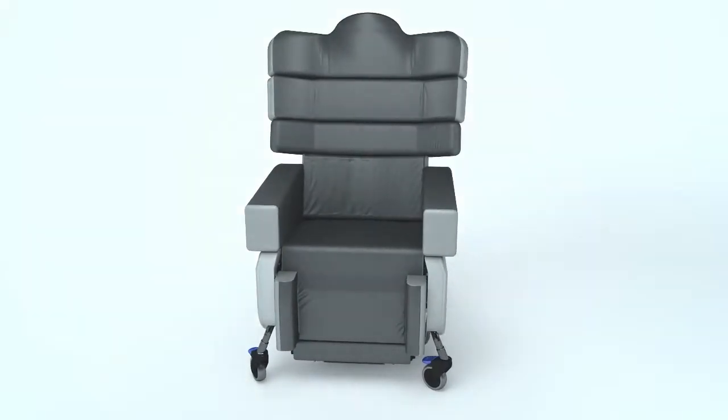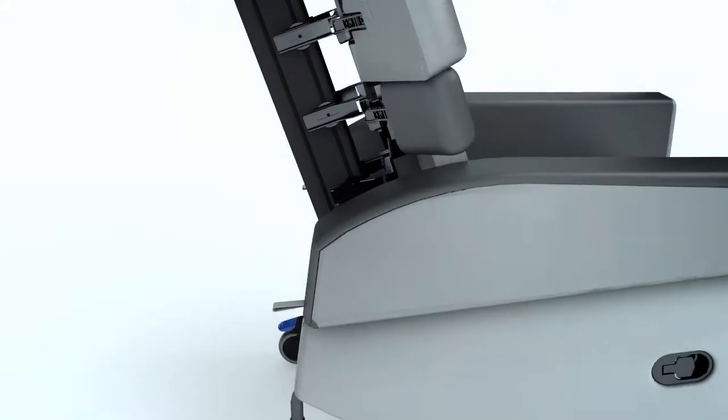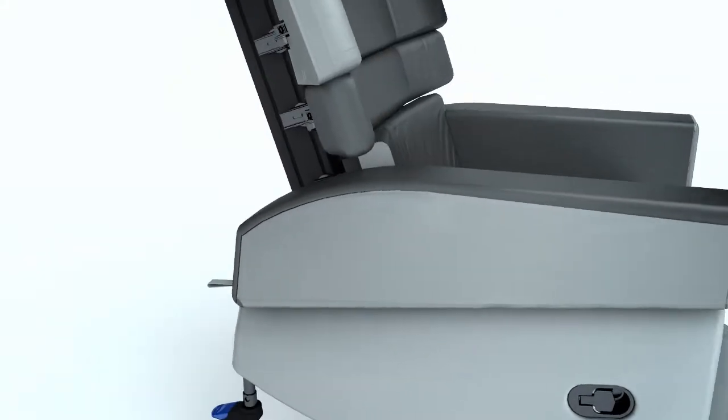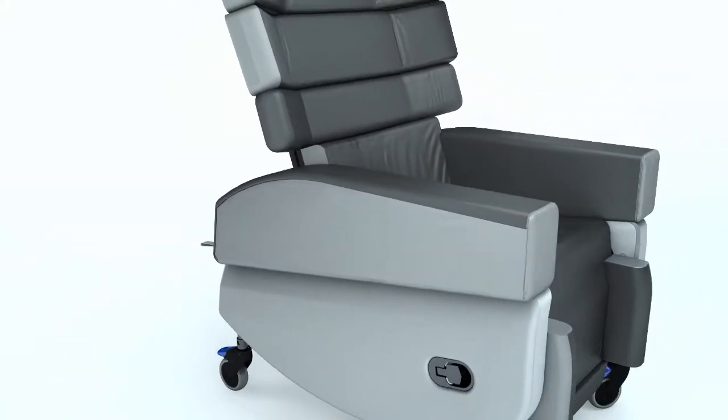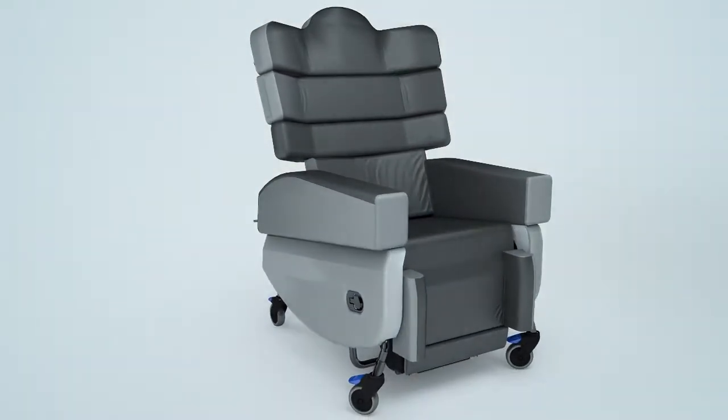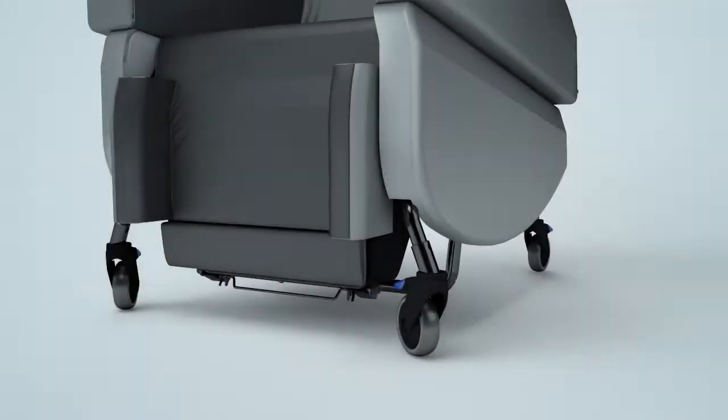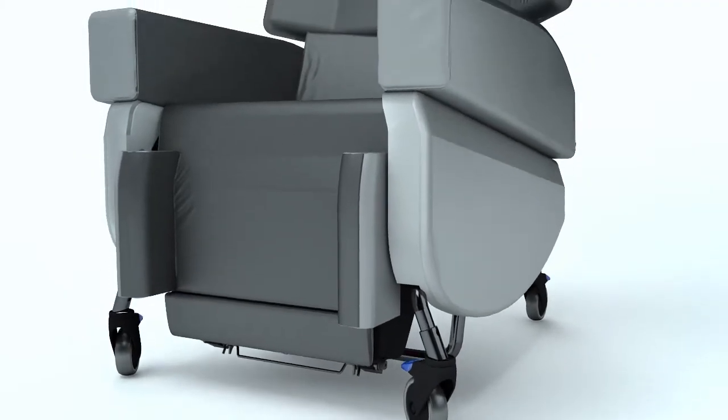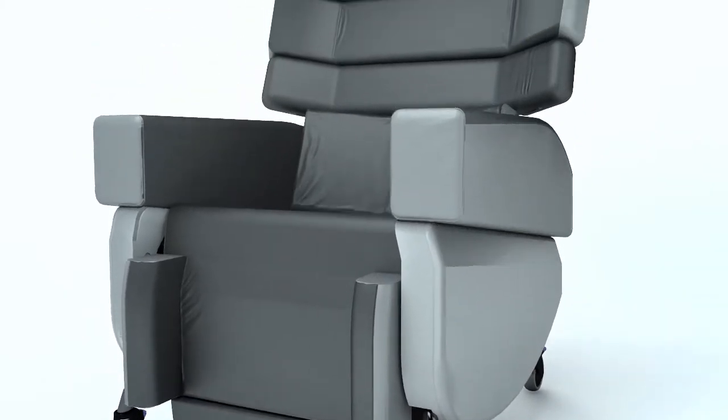The Smart Seat Pro is a highly adjustable modular seating system for clients with complex postural and pressure management needs. There is nothing else quite like it.